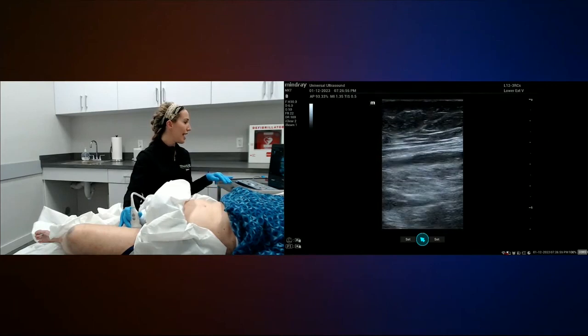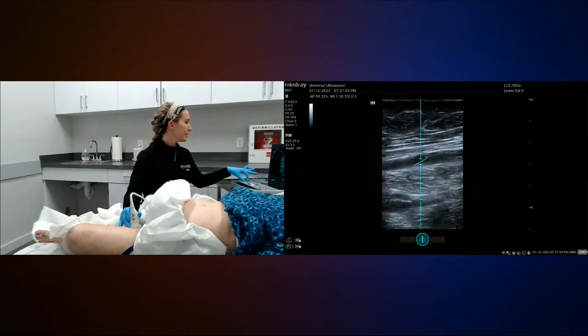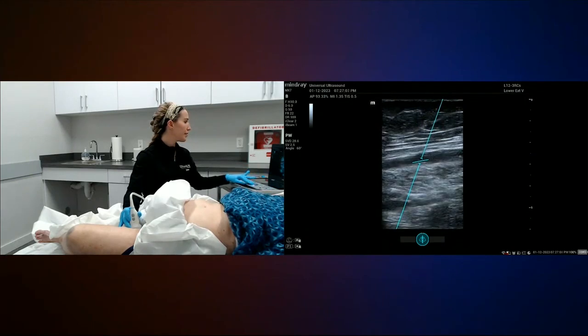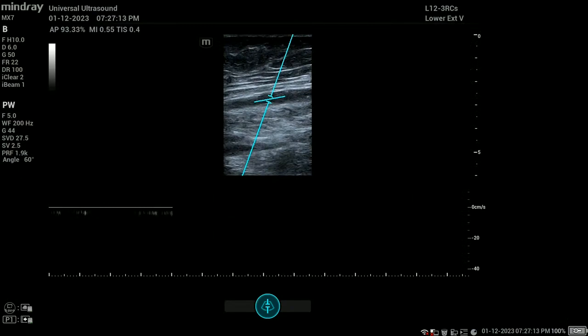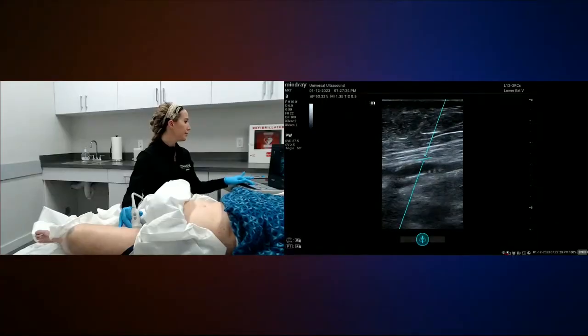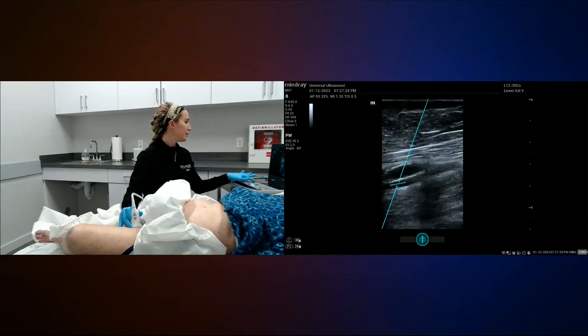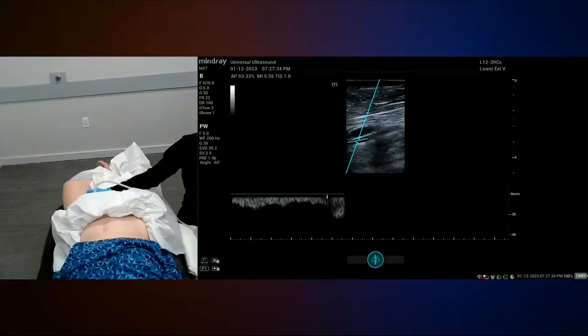So what we can do is when I have a situation like this, I show the doctor, you know, vein 1 is occluded, vein 2 is open. So you can see there's no flow here. And we're here in the artery. Come in. So now I'm going to go to vein 2. And we can see we have basic flow. Go ahead, Barbara, do a foot flex for me. Good, thank you so much. And flow augments.